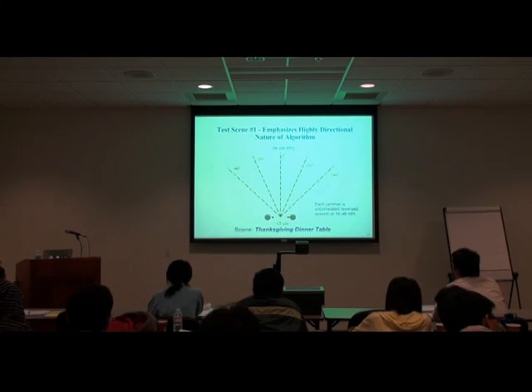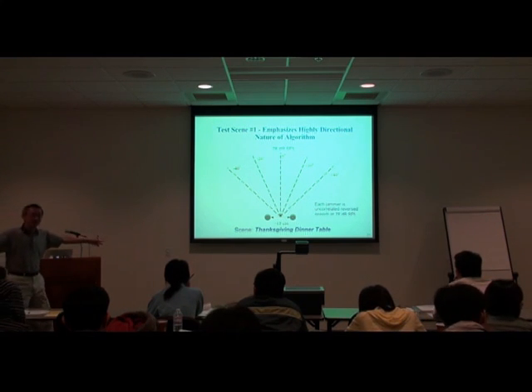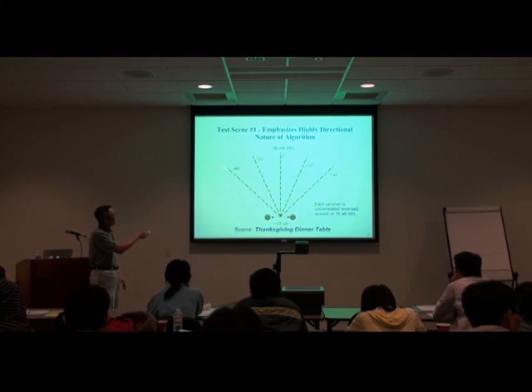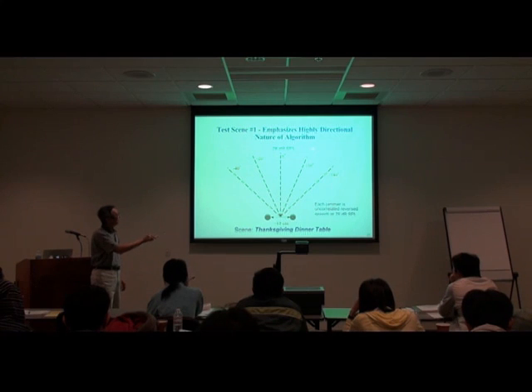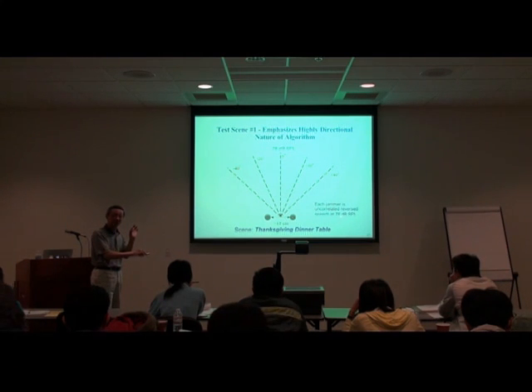So the first testing condition is what we call the Thanksgiving dinner party, right? At Thanksgiving, you're at a table, and you're talking to people in front of you. Let's say there are 5 individuals here, and you're trying to listen to this target at 78 dB SPL. And the others are talking also, maybe to their counterparts across the table. They're all talking at about the same level, and therefore this is a very difficult situation for us to listen to.